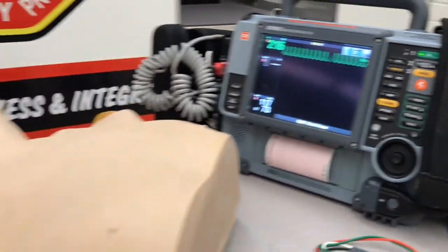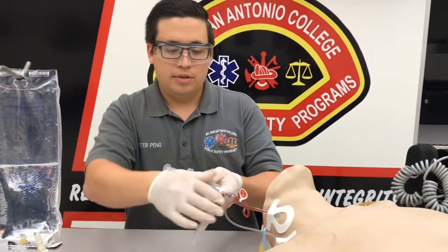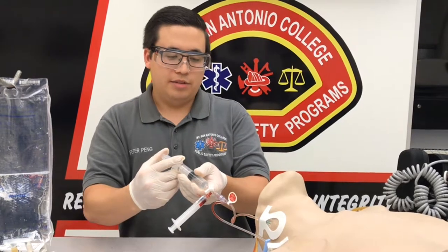I'm going to first slam the adenosine, swap it, and slam the flush.